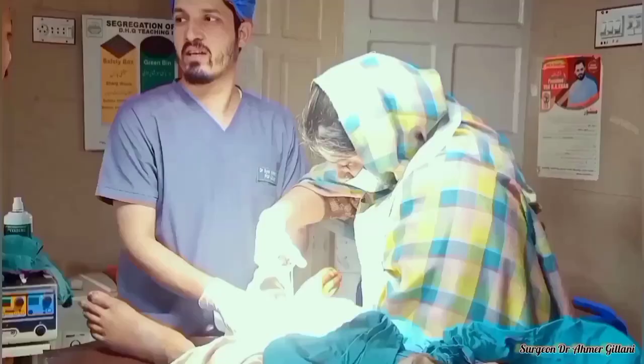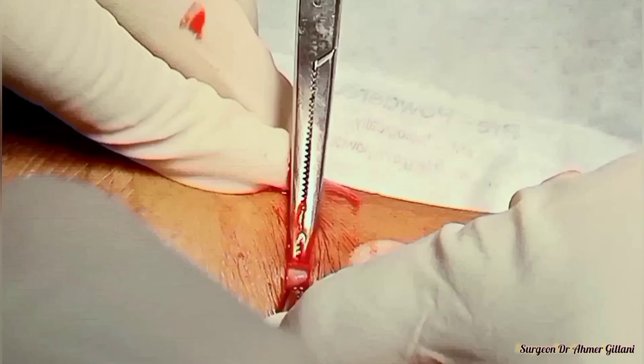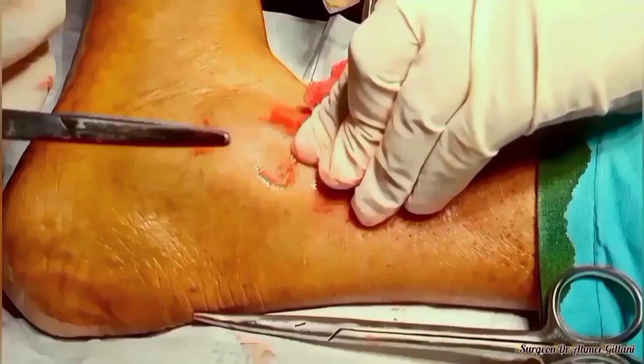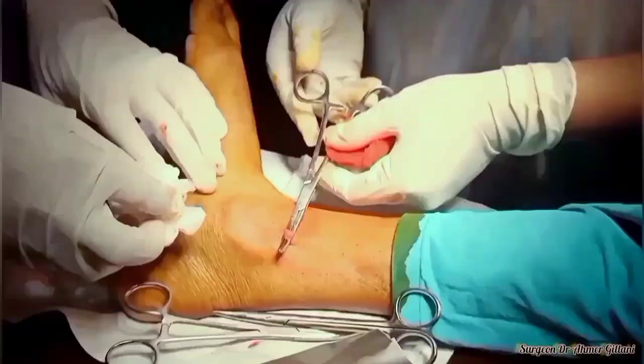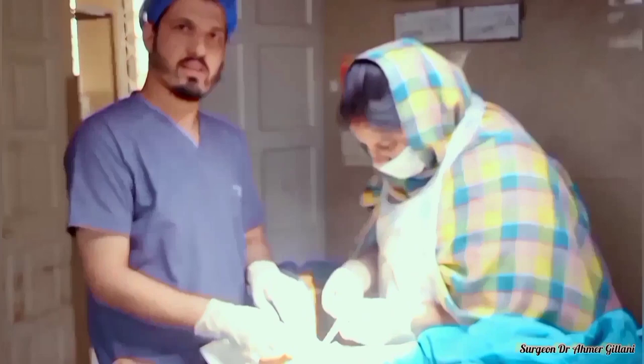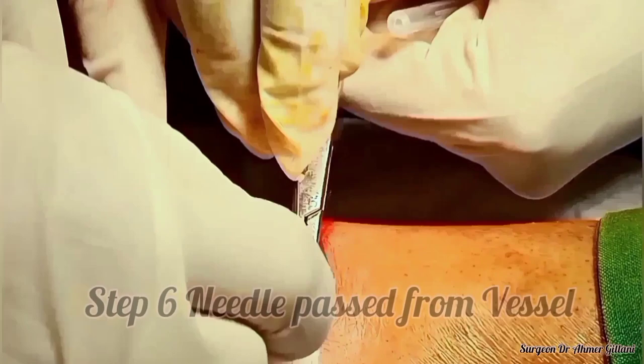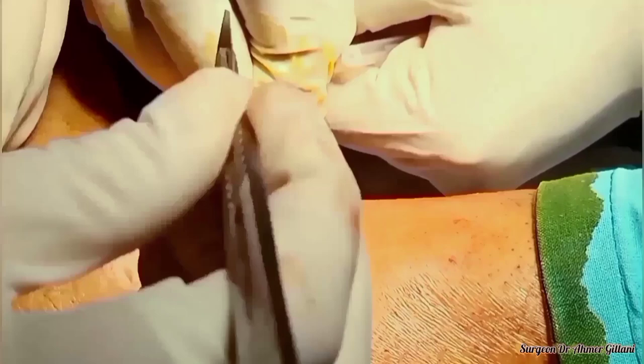The bluish color identifies the vein. The technique is we will make the space beneath the vein, and we will pass the artery forceps beneath the vein and lift it up. After that, we will use a needle to pass from this area from the anterior wall.